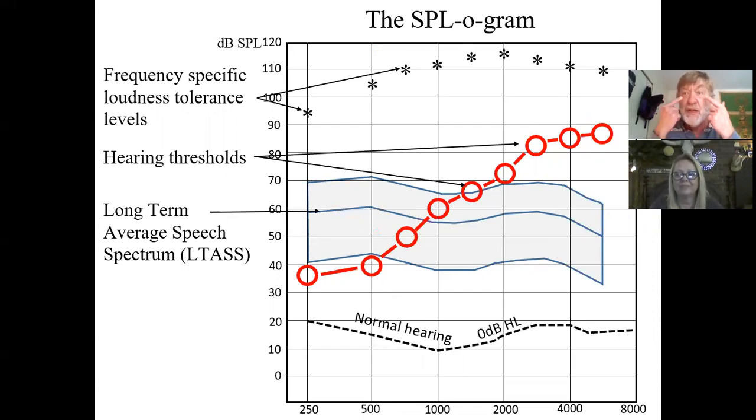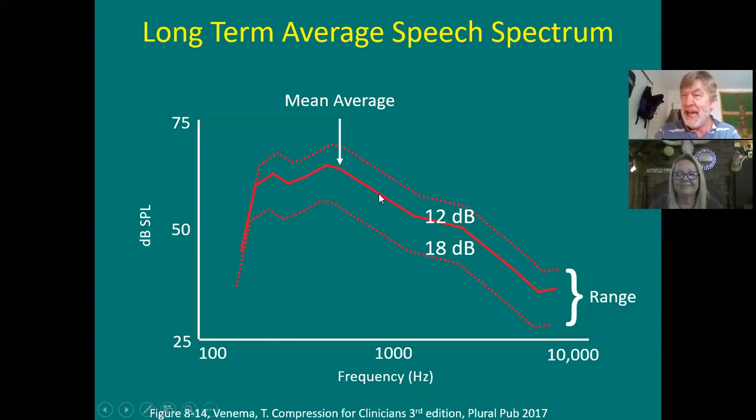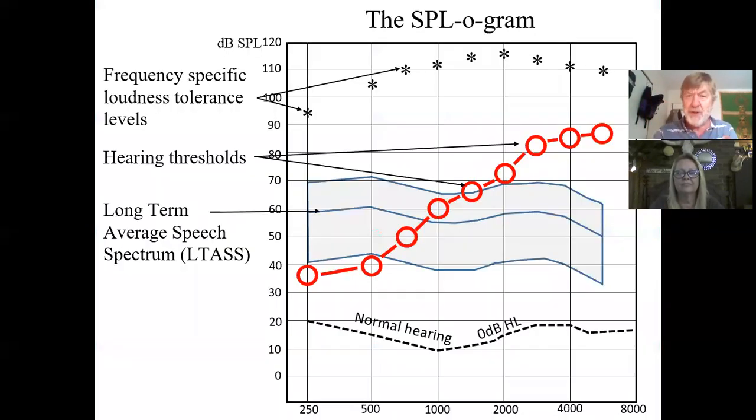You are able to see what they hear by doing real ear. So that's what I meant by you will encounter this again. You're learning about it here because that's how digital hearing aids determine whether something's noise or speech. But you're also going to be learning it in real ear, in terms of your goal is to make this blue banana here sit right where my cursor is.